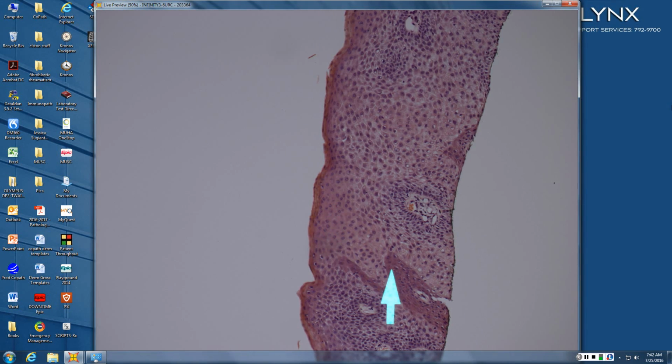Why is this epidermis different from that epidermis? Which is normal, which is abnormal? It's more pale. So the pale, where the arrow is now, is probably the abnormal. If this were a clonal seb, all of those pale areas would be surrounded by normal. In this case, the two are more side by side, right? Instead of the one surrounding nests of the other.